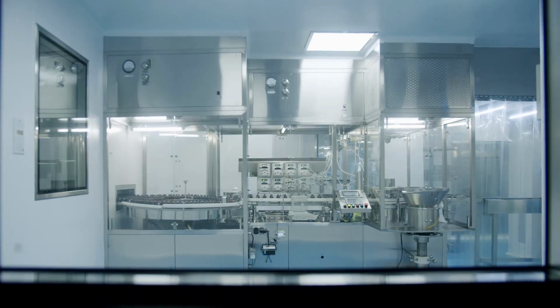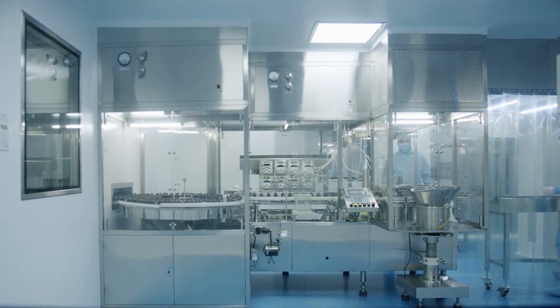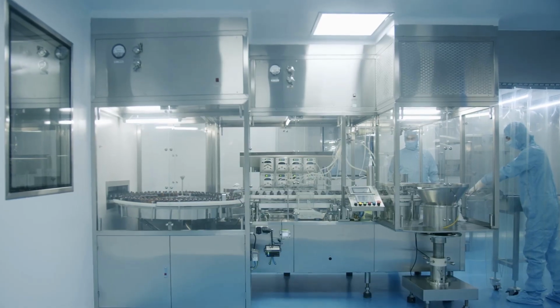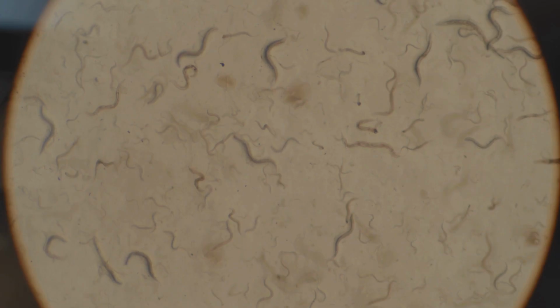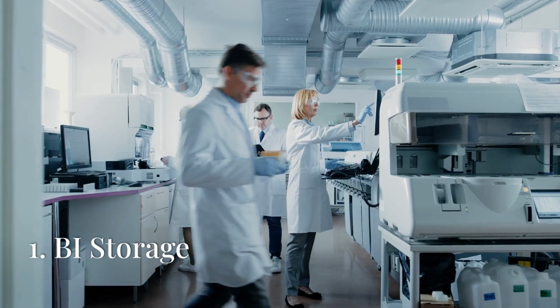We all know how important sterilization of medical devices is. BIs enable validation and continued verification of the validated sterilization cycle. BIs contain viable microorganisms that provide a defined resistance to a specified sterilization process. These live microorganisms live within the BI strips, coupons, liquid, etc., and need to be cared for properly. There are two main points we want to stress regarding BIs.